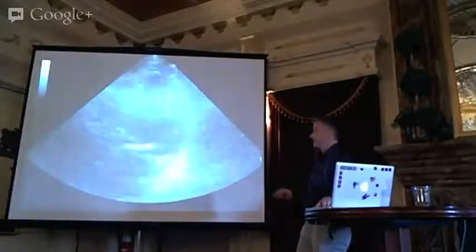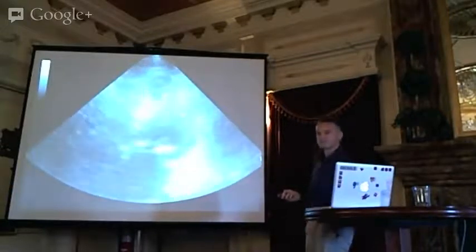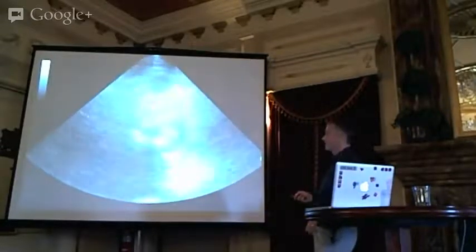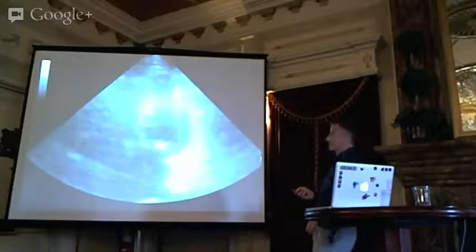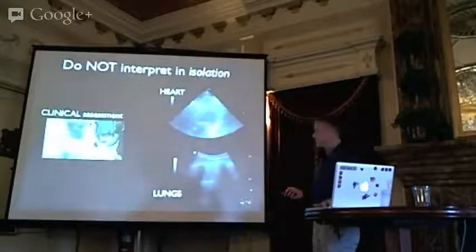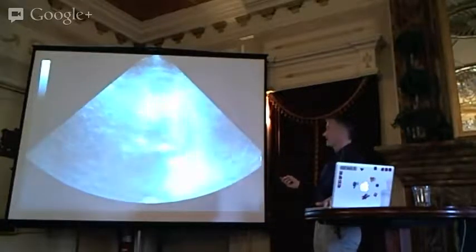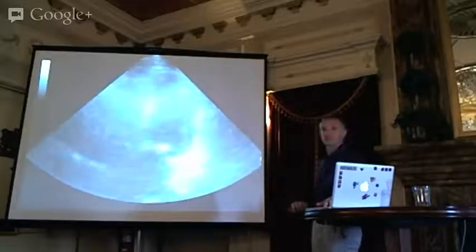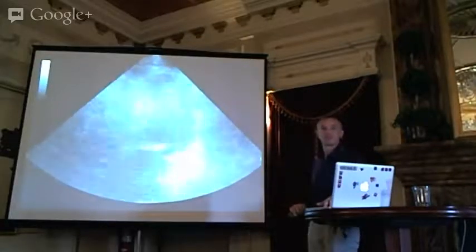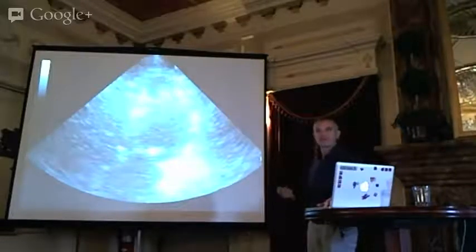And he had this apical view of his heart. He's got no fluid around the heart, the RV size we can't really comment on. But the LV, look what's happening to this endocardial border as they're meeting, opposite sides of the heart are meeting. That's called a kissing ventricle, that's a sign of hypovolemia. The collapsing IVC, kissing ventricle, it's hypovolemia, respond to fluid.